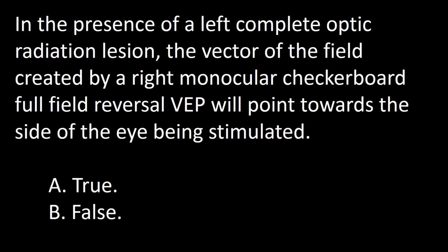Next question. In the presence of a left complete optic radiation lesion, the vector of the field created by a right monocular checkerboard full field reversal visual evoked potential will point towards the side of the eye being stimulated. A, true; B, false.